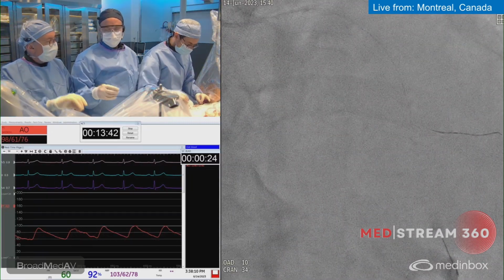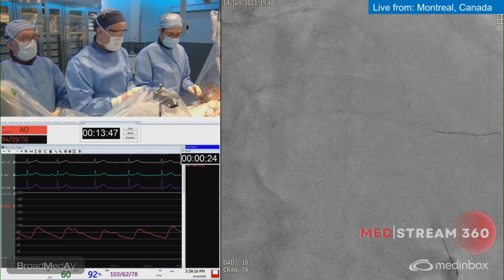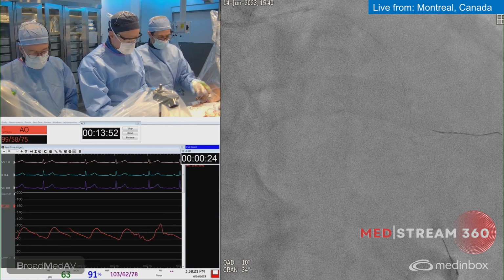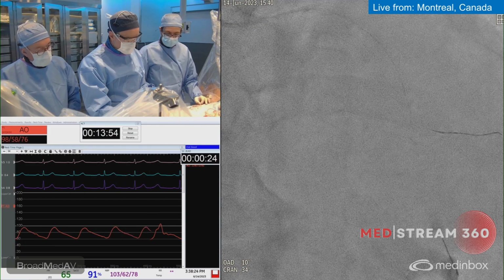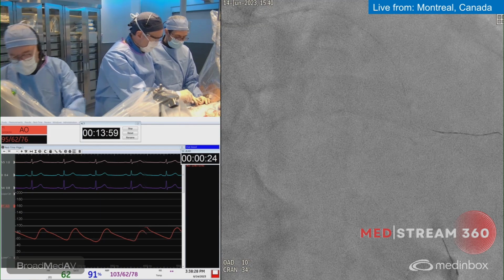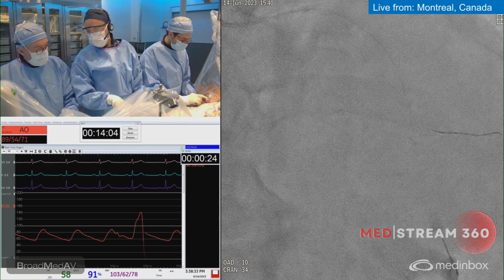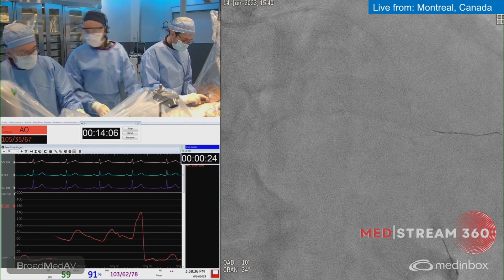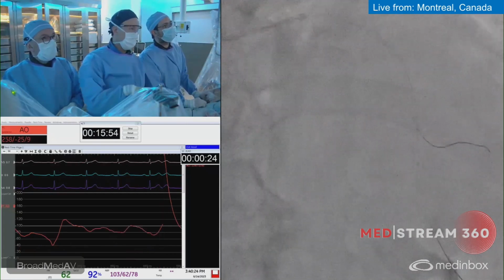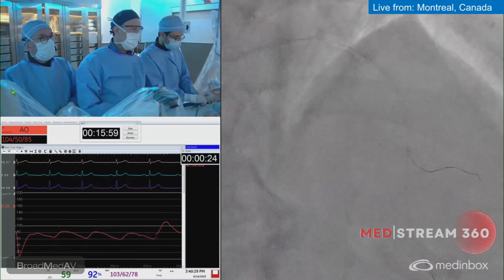So I don't know if you can see it, but basically the shockwave balloon here looks like a normal balloon with just a little bit larger profile. A larger profile, right? Yeah. I mean, I think there we go. In some way, it changed a bit our approach to some calcified lesion when it's deep calcium. Yeah. So we're just going to inflate here, and as we inflate, you can pull on the balloon to engage properly. Okay. Yeah. So we go to 6 atmospheres.